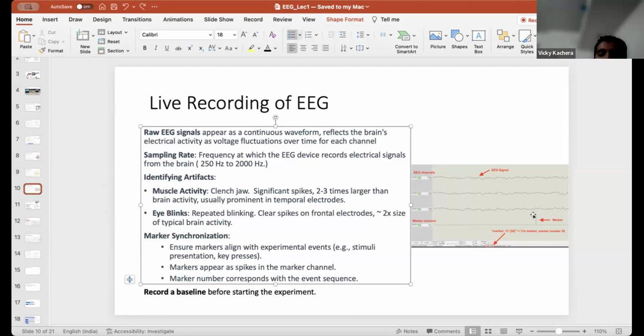When we recorded the first pilot data, Nitesh was saying to mark for the baseline. But we have already marked those. As you mentioned, it was recorded and it's already there in the audio. Exactly at 3 minutes, they will get the notification that they can start Yog Nidra. But if it is not recorded, then we need to mark it. You play a recording of the resting state, then you spend 2 to 3 seconds putting up the other recording. Then you can mark this is where Yog Nidra started.